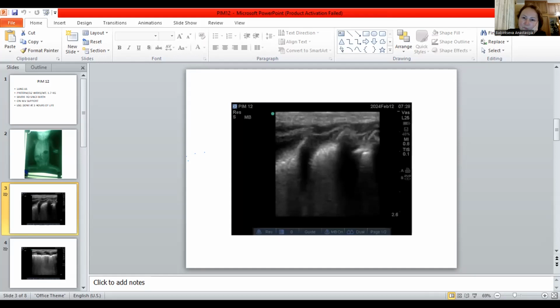A good example: a preterm baby, say 23 to 25 weeks, who has had surfactant and is not saturating, and I'm worried the lung looks atelectatic. I would do a scan from anterior, lateral to posterior. If the posterior lung is atelectatic, recruitment maneuvers would always be in slow steps early on, because the anterior areas of the lung in a supine position with surfactant, and the right lung, even with a tube in good position, tend to aerate better.